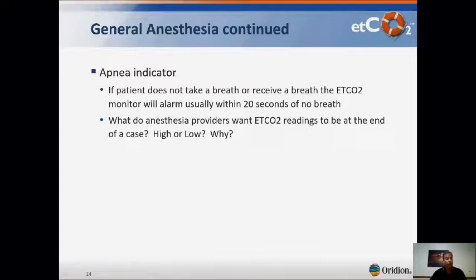CO2 in anesthesia is used as an apnea indicator, so it lets them know when they are not breathing, so it gives you an alarm within 20 seconds.